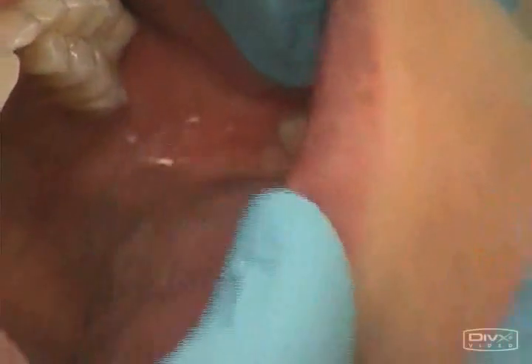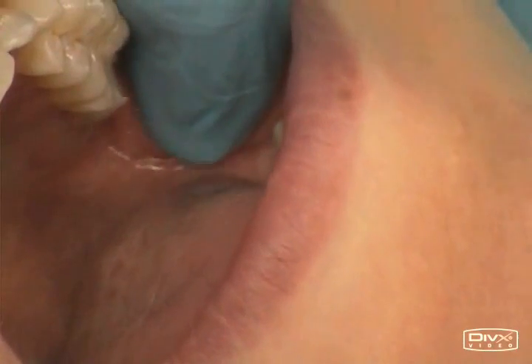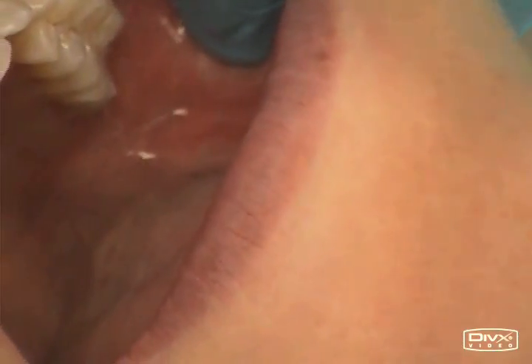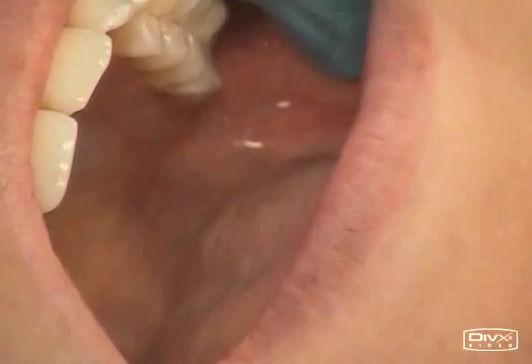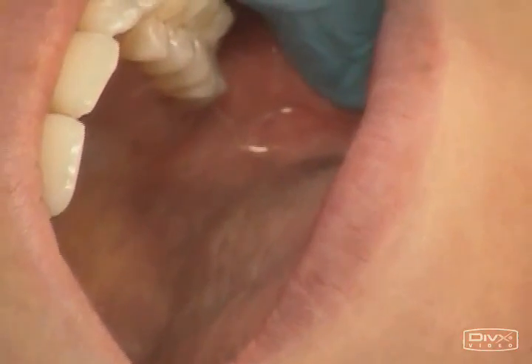We're going to do an inferior alveolar nerve block on the left side. The nerves to be anesthetized are the inferior alveolar nerve, the incisive nerve, the mental, and the lingual nerve.